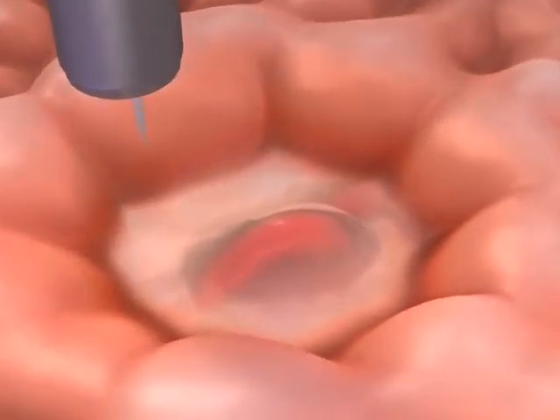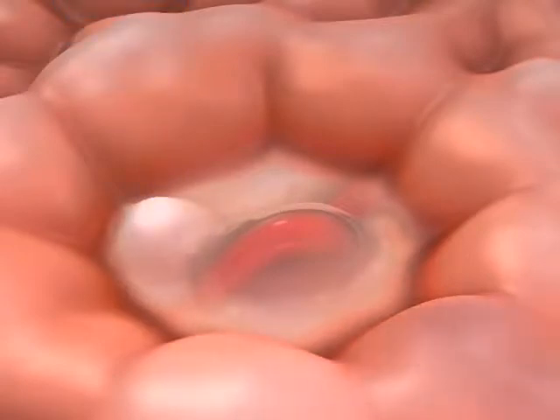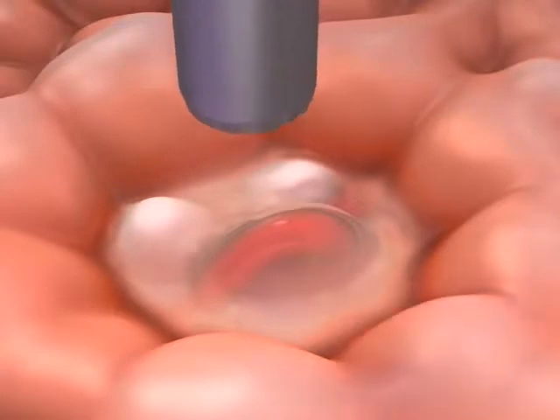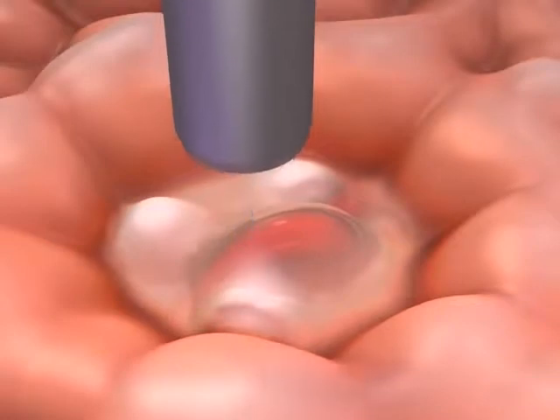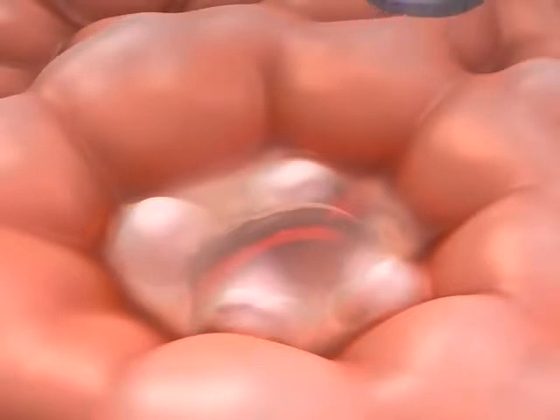The technique of submucosal injection provides a volume tamponade effect plus possible local vasoconstriction and platelet plug facilitation. The endoscopist should observe the raising and subsequent blanching of the targeted and surrounding mucosa. Injection of diluted epinephrine or saline alone as monotherapy is inadequate and should be avoided. Instead, injection of epinephrine plus saline in a 1 to 10,000 dilution, followed by injection of another agent or combined with contact thermal therapy, is preferred.